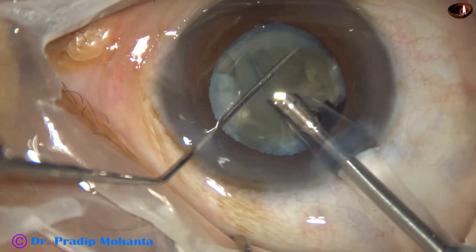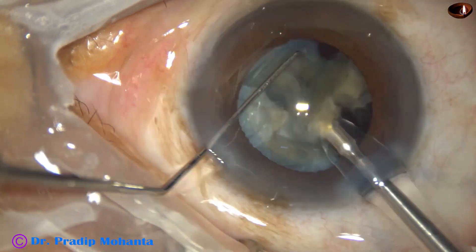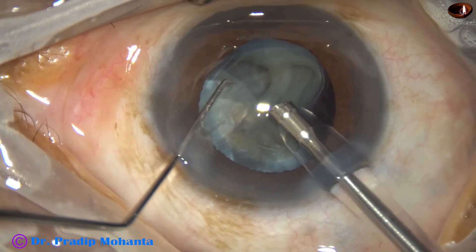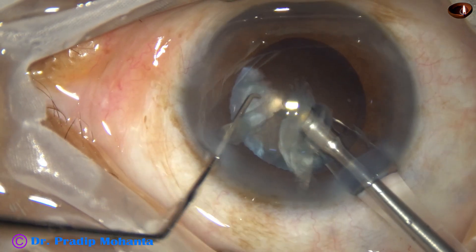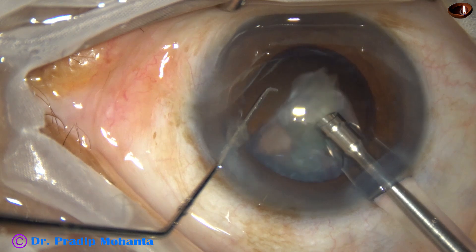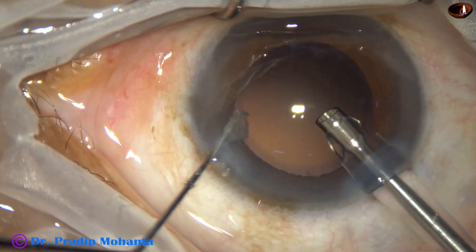Now one by one, the pieces are being emulsified. Ultrasonic energy used in this case is 80%, flow rate is 45 ml per minute, vacuum is 450 mmHg from start. This is the last piece of the nucleus — vacuum is 400 and flow rate is 40.